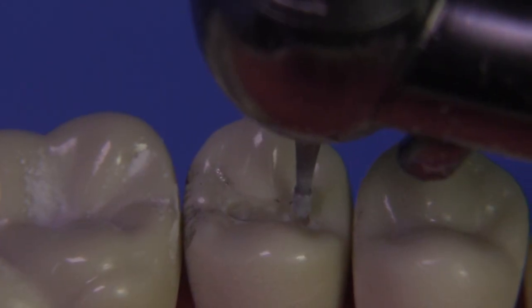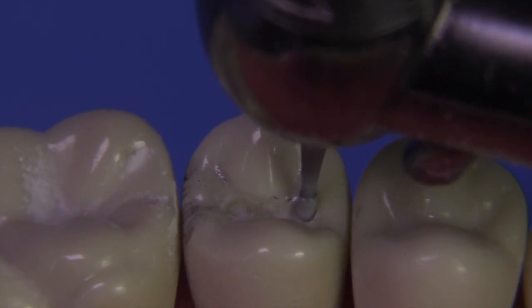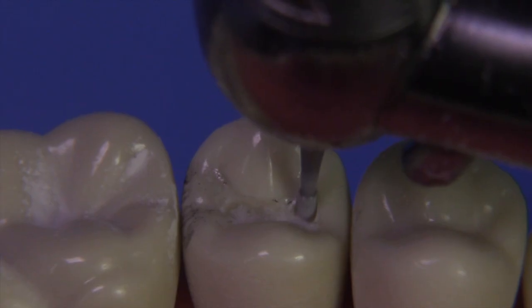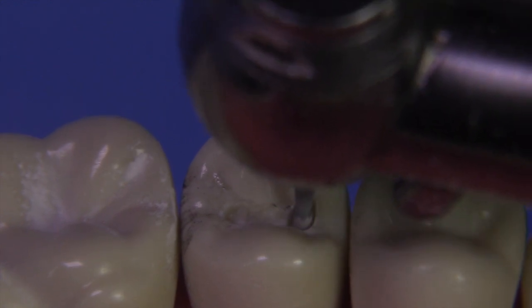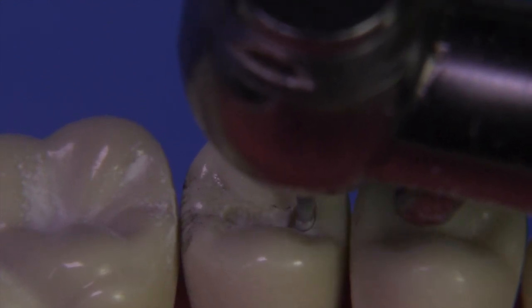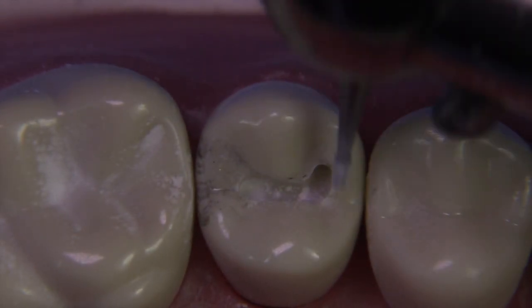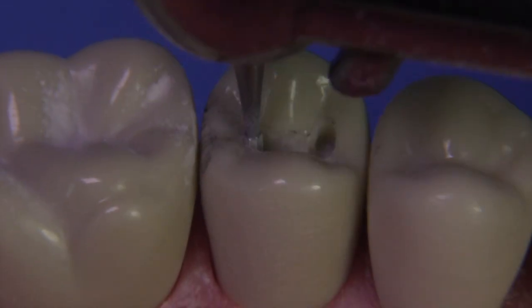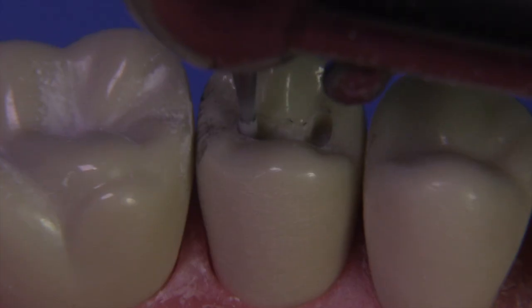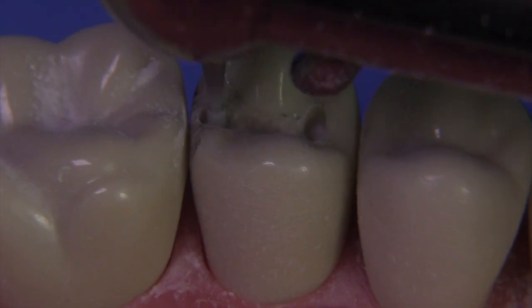Let's get started on the dovetail. Notice how we're tipping the burr slightly to the mesial — that's to create a slight divergency to that mesial wall, which will help support the marginal ridge and resist fracture. If we held the burr perfectly upright, we might create an undermining of that marginal ridge. The dovetail is about a little more than half the width of the burr, going facially. I typically don't go lingually — we can get plenty of lock by just going toward the facial.